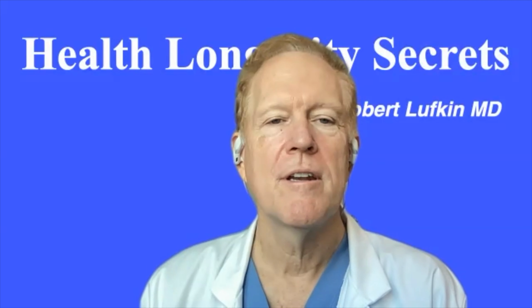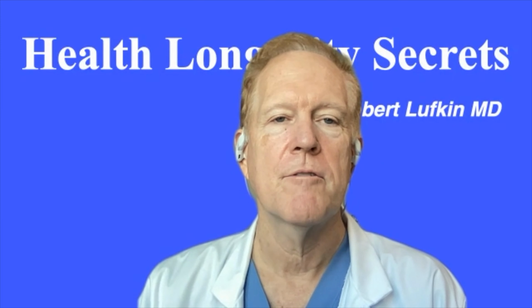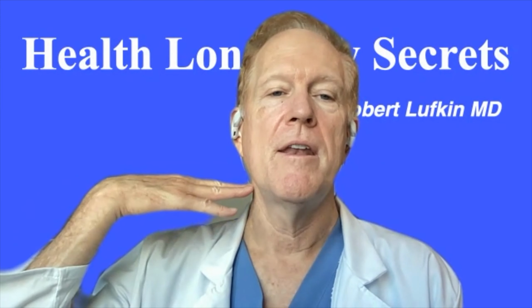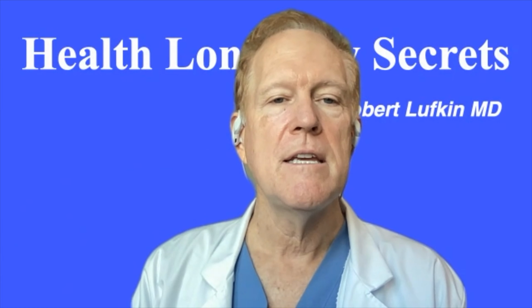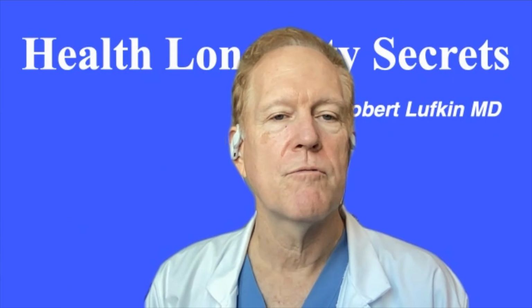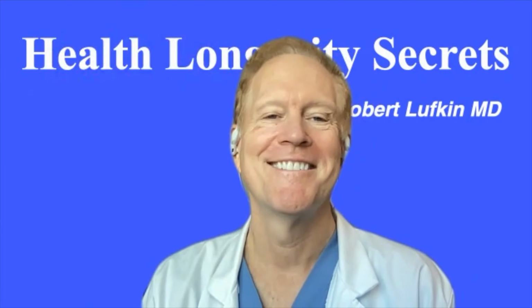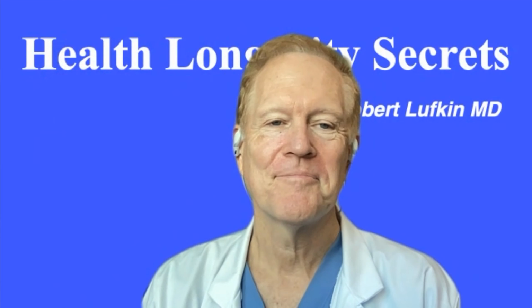Now you mentioned that to do this body composition with magnetic resonance imaging, you scan from the neck down to the knees. Maybe tell our audience why those choices were made? Why wouldn't you scan from the top of the head to the toes? Because you don't have that much fat in your head. Well, you have some fat, but it's mostly around your neurons in your brain, and not that many things happen up there.